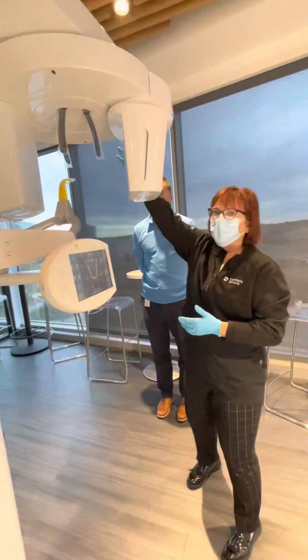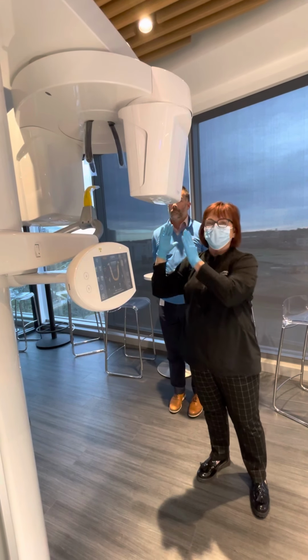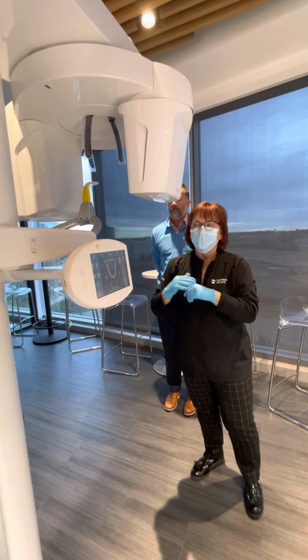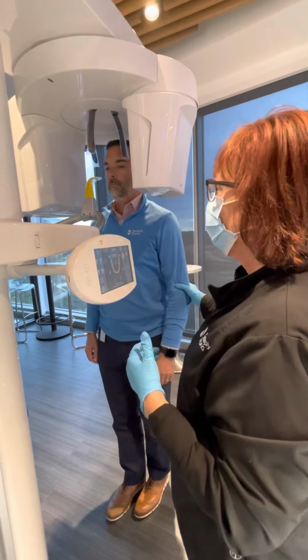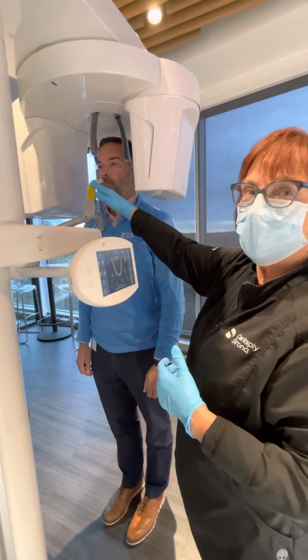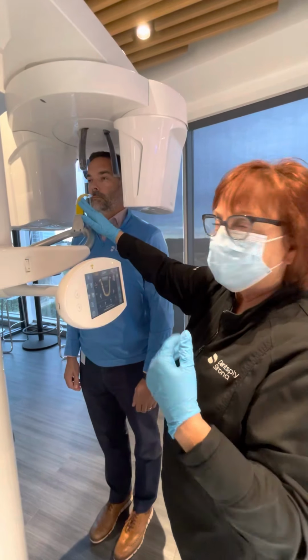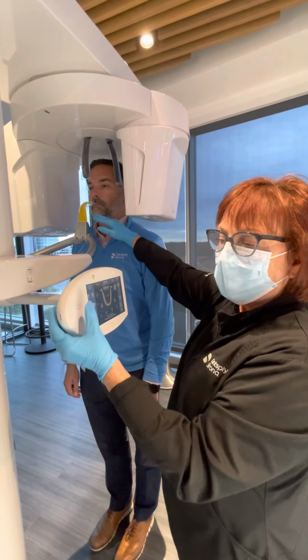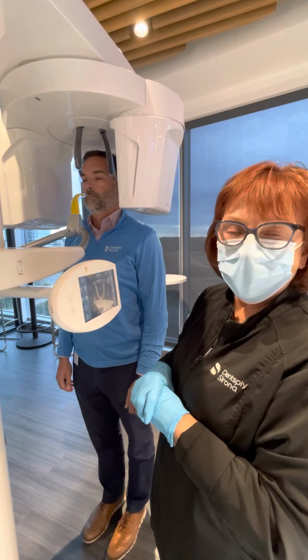I'm going to open up the machine just very gently so that the patient can walk straight into it and they will not be off center. The next step is to have the patient come up, and the first thing I want to do is to check the level of the bite block. Make sure you choose the right bite block for the image that you're taking. This happened to be pretty good, but I could lower or raise the machine as needed to get this ready for him to walk into.